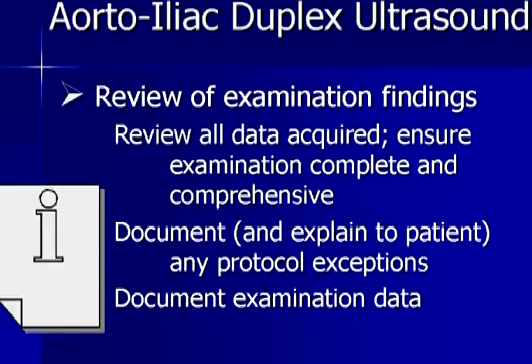Well, finally, you've completed the examination. Then what do you do? Well, you have to review the findings first to make sure that they're complete. Make certain that you have acquired all the necessary data, that you've done a comprehensive examination, that all of the data one needs is there to make a complete diagnosis. If there are any exceptions to your protocol, you should, at least on your worksheet, document these, and it's helpful to explain this information to the patient as well, because they may come back with these questions and say, why did they not tell me this was not a complete study? So feel free to explain these limitations to the patient themselves at the time they're there. It's good public relations and enhances goodwill throughout.